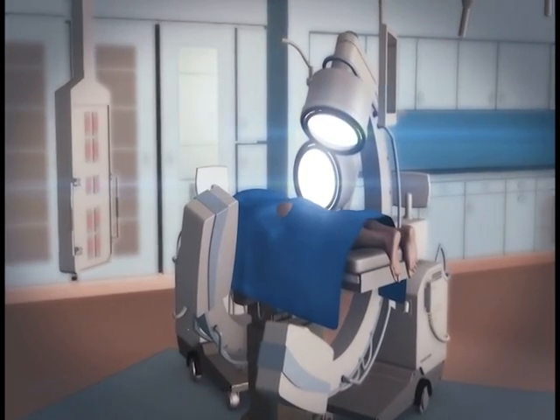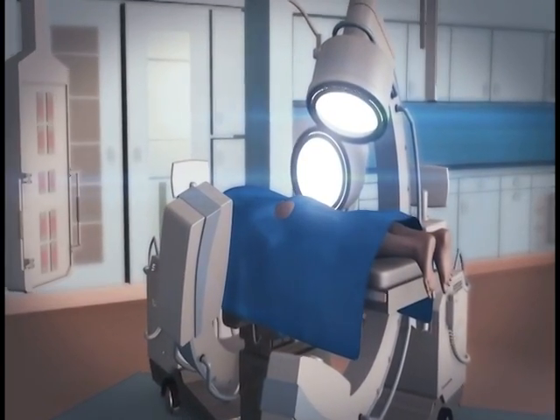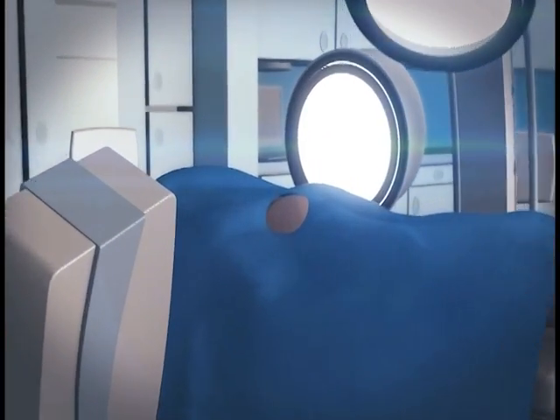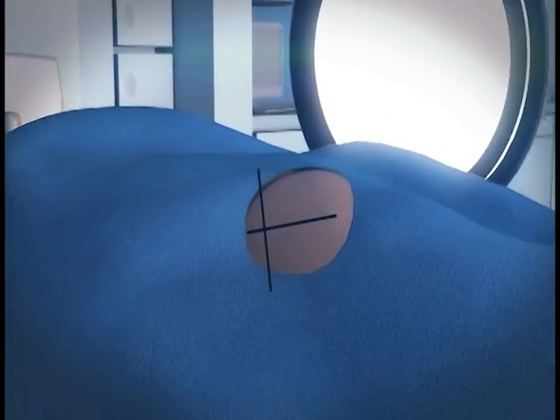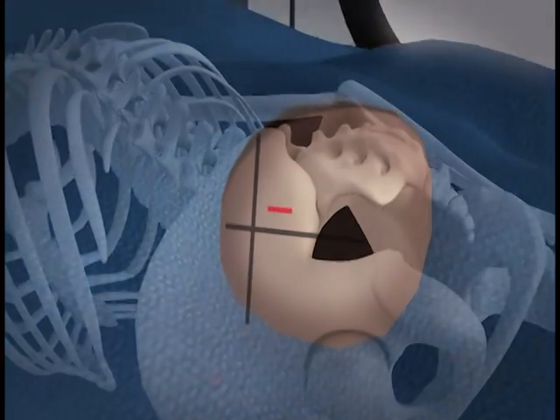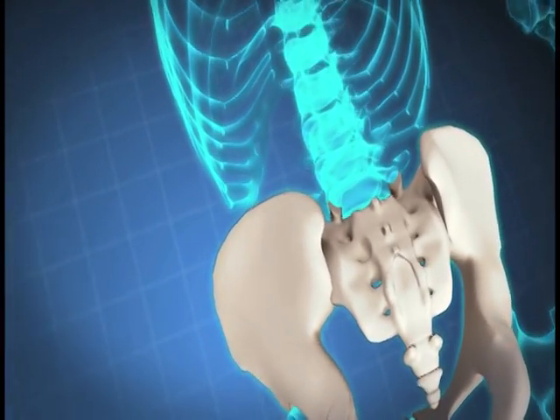Position the patient prone on the operative table using two C-Arm fluoroscopy units to provide simultaneous lateral and Ferguson's views. Use a long blunt Steinman pin to locate and mark the skin along the S1 end plate and sacrum posterior cortical wall. Make the incision approximately one centimeter below and approximately one centimeter posterior to these two lines respectively. The incision should measure approximately two centimeters.